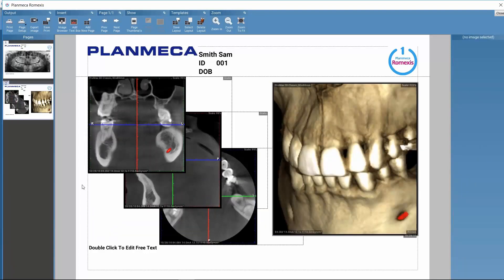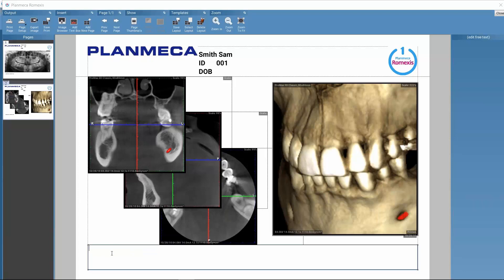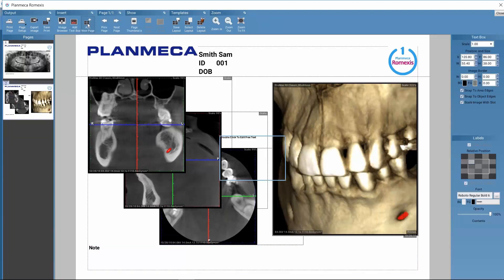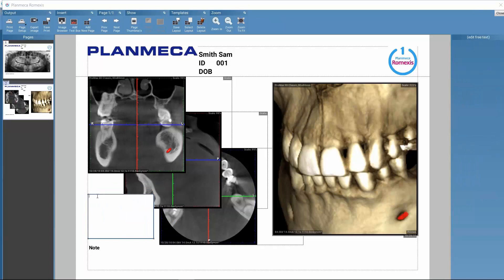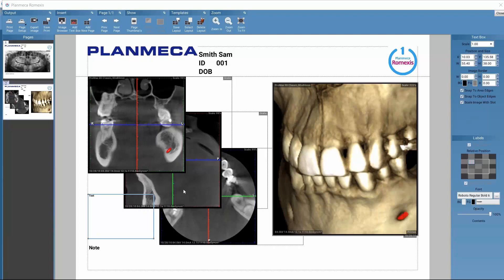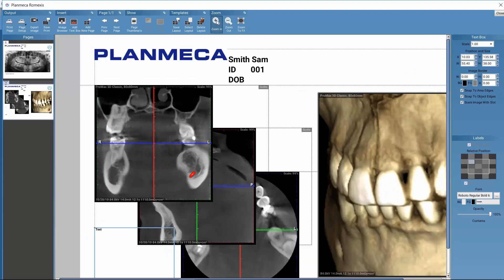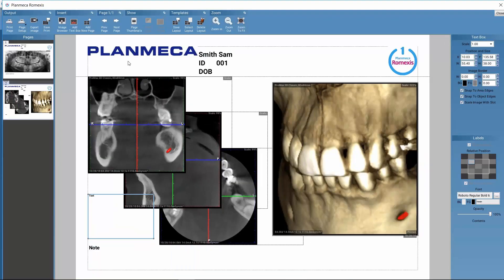Let's take a look at how we can add text to the printout. In this template we already have a text box, so we could write anything there. We can also add a new text box — if I add an empty text box, I can write text there as well. On the right side we have options for scaling and positioning this text box, adding borders, and managing the font. We can also zoom in and out to see more details when working with the printout, or zoom back to fit the screen.